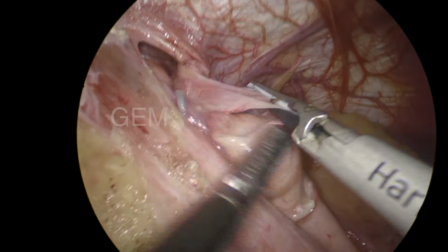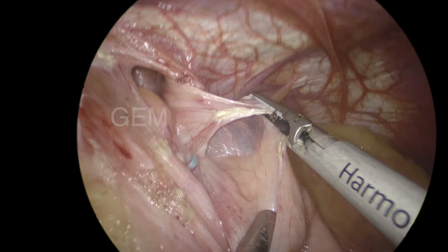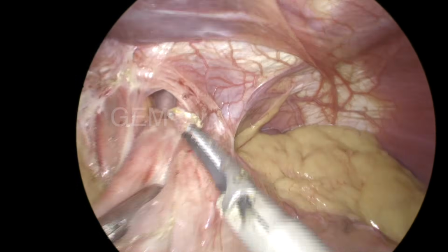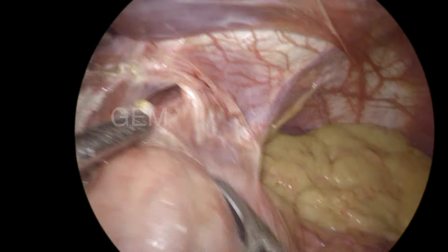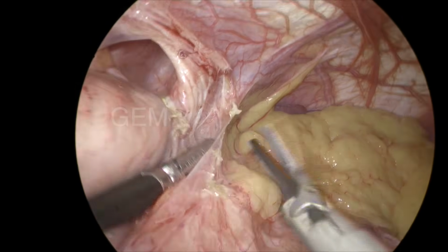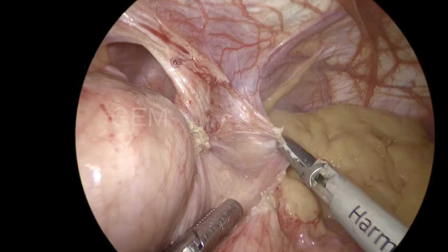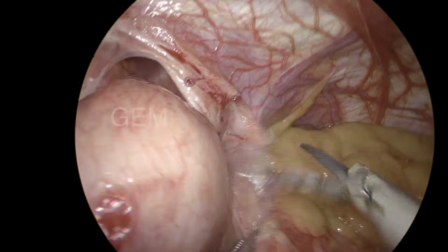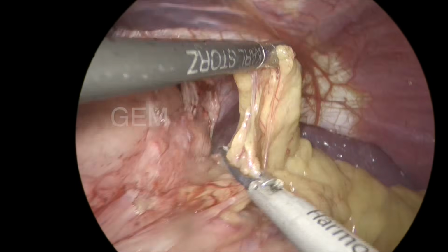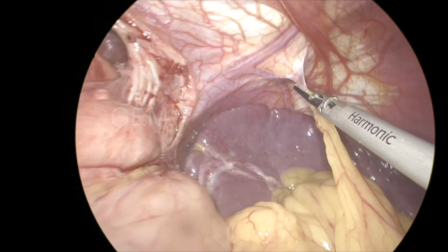So all the adhesions from the wrap to the crus are being lysed with the harmonic scalpel, and we have to be careful. We should not injure the vagus. So the already dissected area is there, and laparoscopic cardiomyotomy was done. On the anterior surface of the esophagus, only the mucosa will be there. The muscle will be divided. So I have to be careful when I give traction and then do the anterior dissection on the esophagus. These are the omental adhesions to the migrated stomach being released.